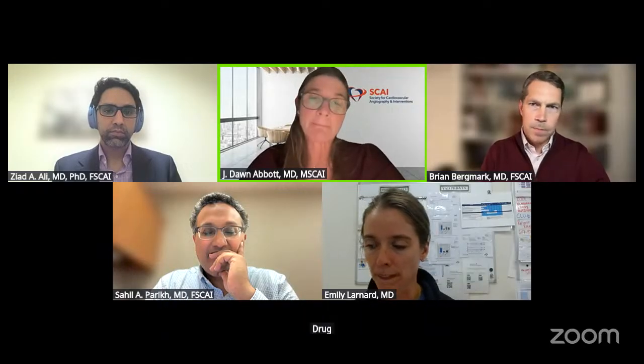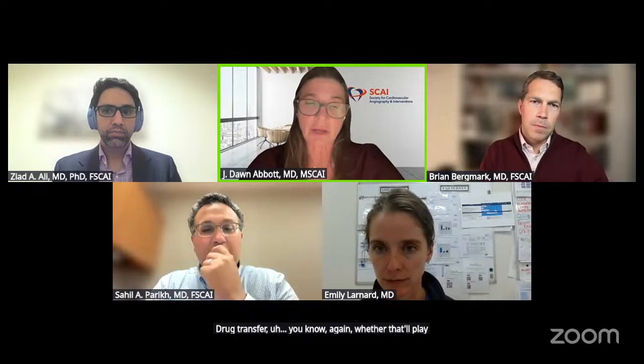So I think certainly there is some preliminary data on DCBs using, say, cutting balloons or scoring balloons as opposed to regular balloons for a more efficient drug transfer. Again, whether that'll play out into clinical outcomes, unclear.